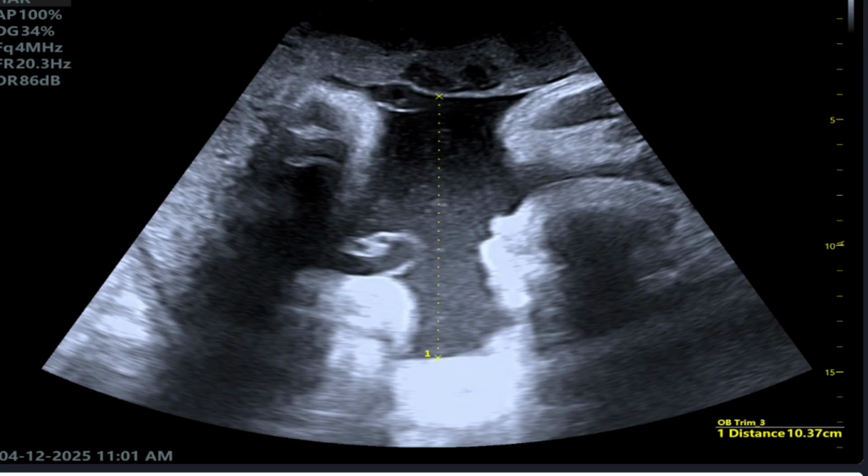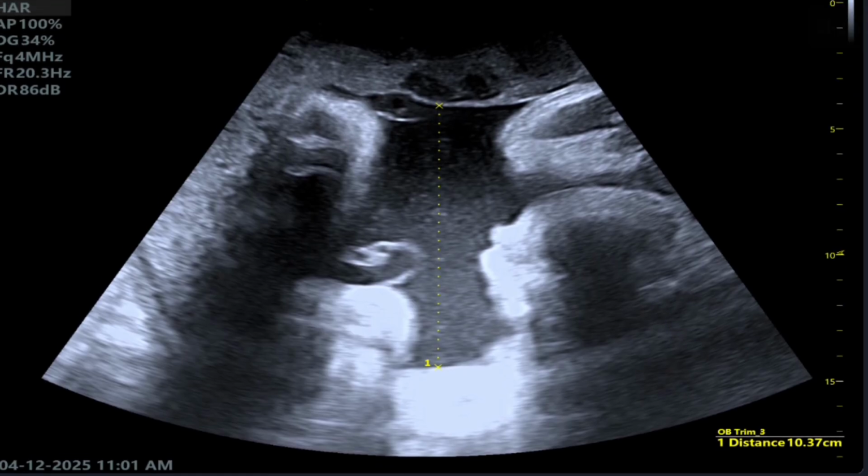Here is another sonogram showing measurement of a single deepest pocket. Now the measurement here is 10.3 cm. This is a little bit above the normal, but I brought this image to show you. If you look closely within the amniotic fluid, we'll notice some echogenic material, some form of debris. In another video, we will discuss such findings.